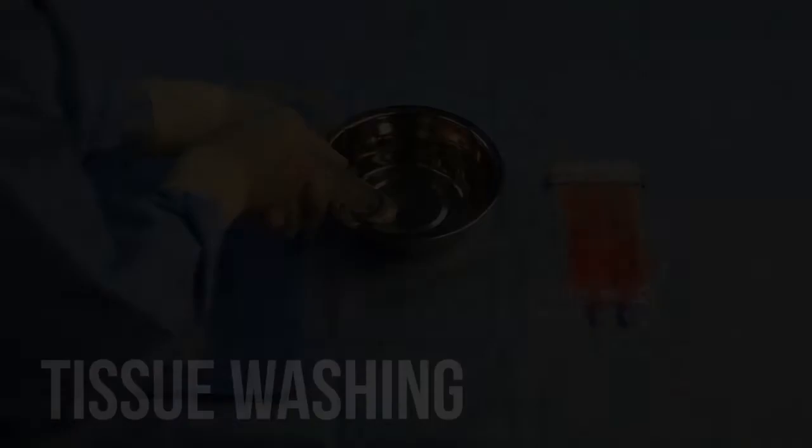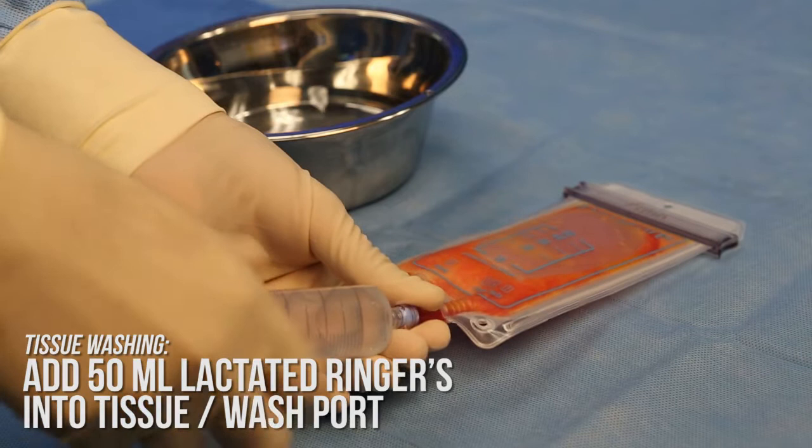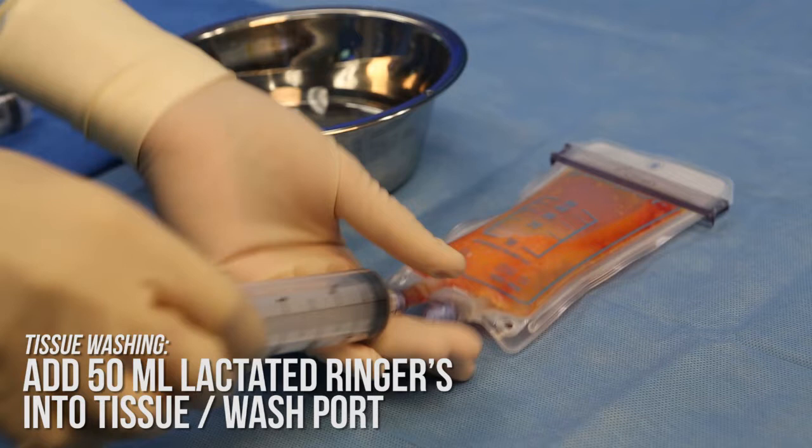Taking a 60 milliliter Luer-lock syringe, transfer 50 milliliters of lactated ringers into the PureGraft 50 system using the tissue wash port. 50 milliliters of lactated ringers should be used for tissue washing regardless of the tissue volume present. The PureGraft 50 system has a maximum volume of 100 milliliters, and the total amount of tissue and lactated ringers should not exceed this volume.